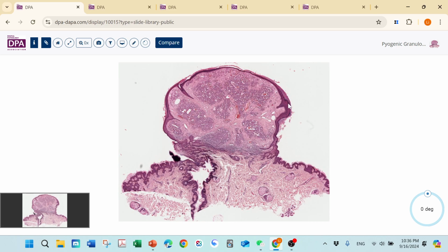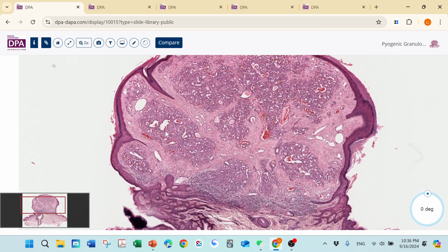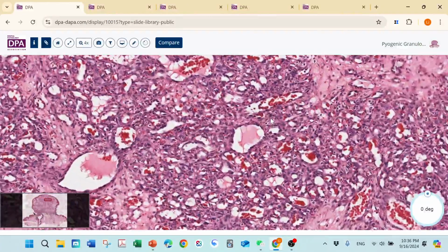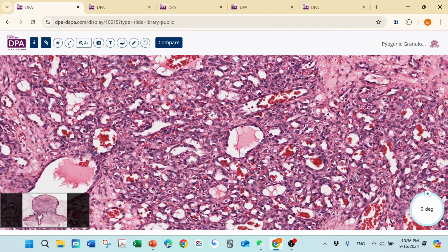That means the epidermis is kind of hugging this structure. And then really characteristic, a big vessel fed by small vessels forming this lobular structure. And then you can see different kinds of inflammatory cells, lymphocytes, maybe some plasma cells and neutrophils, but you won't see one population.